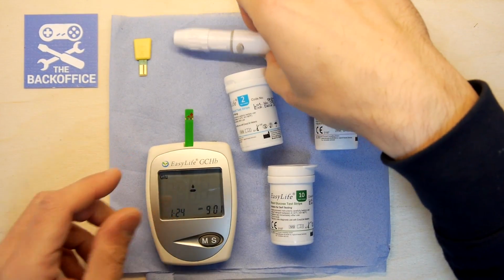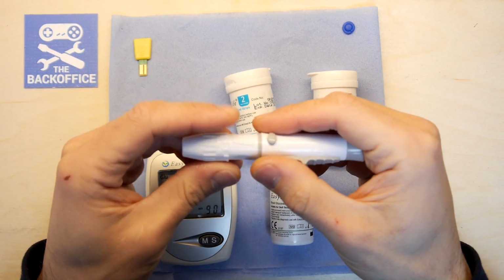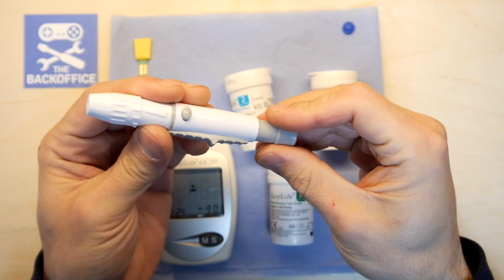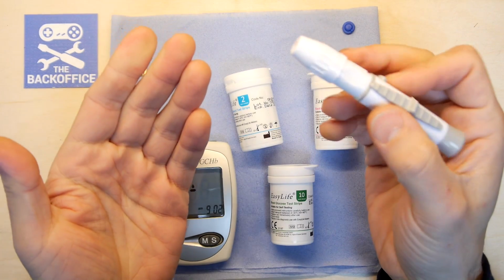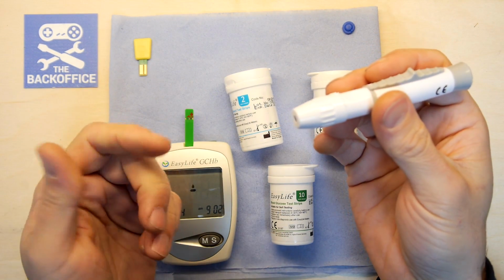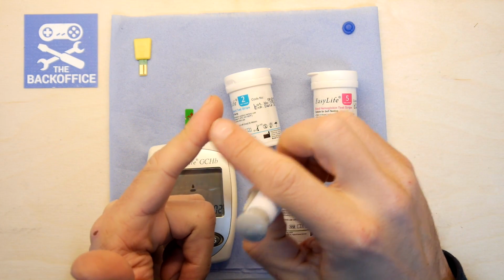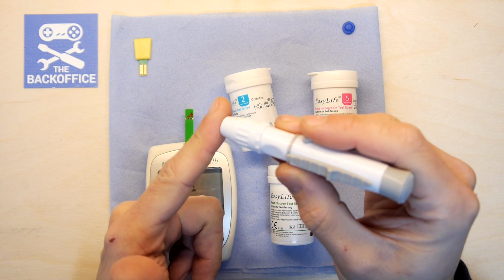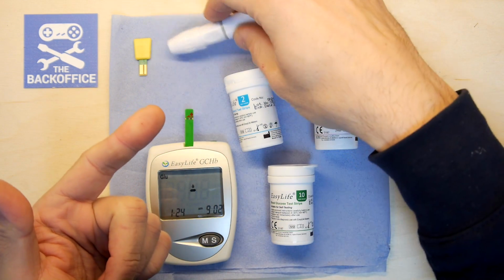I can't put it off any longer. I'm just going to have to let some blood. So I'm going to give myself a 1, 2, 3, 4, 5, a level 5 stabbing. I did bruise my finger last time, and it really hurt. So there's no winners in this game. It's going to bloody hurt. So I'm going to go for this softer, fleshier part here, which feels like it's going to hurt. It didn't really, to be fair.